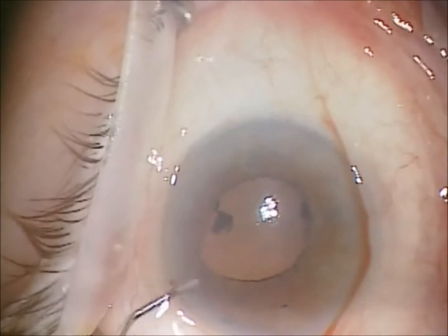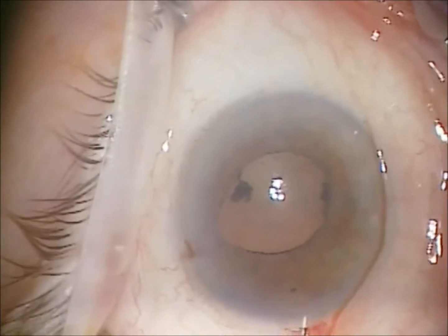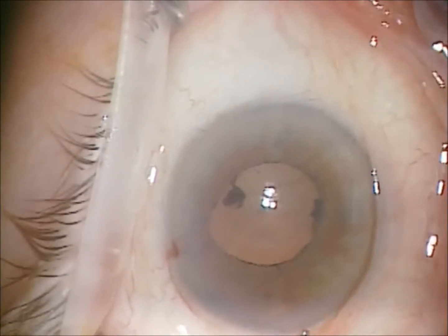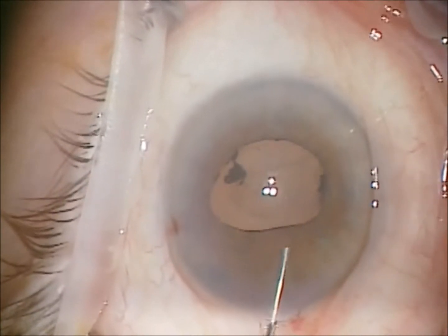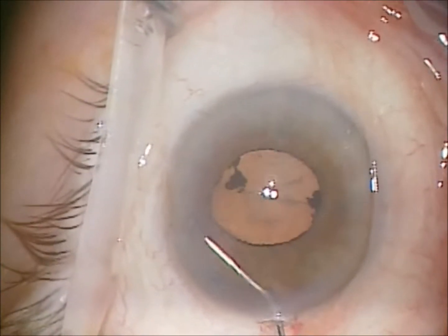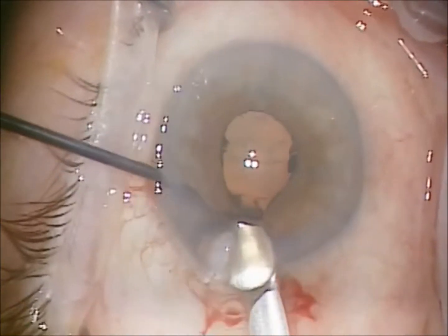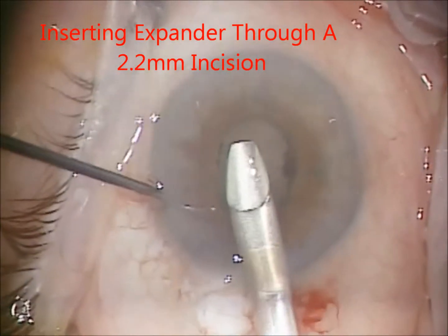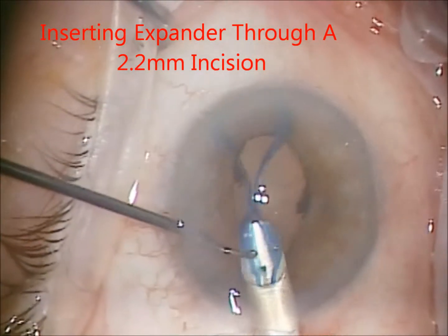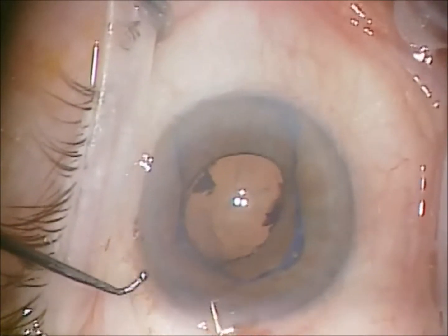The pupil is already quite small, and with this shallow chambered eye I wanted all the room to operate possible, so I elected to put an Oasis pupil expander in. I put some Alcon Discovisc in first, and then through a 2.2 millimeter incision the Oasis expander is inserted.